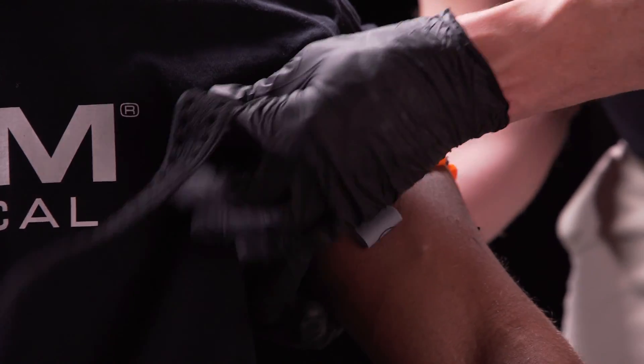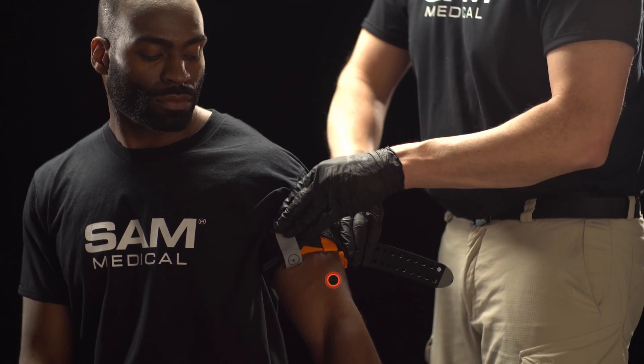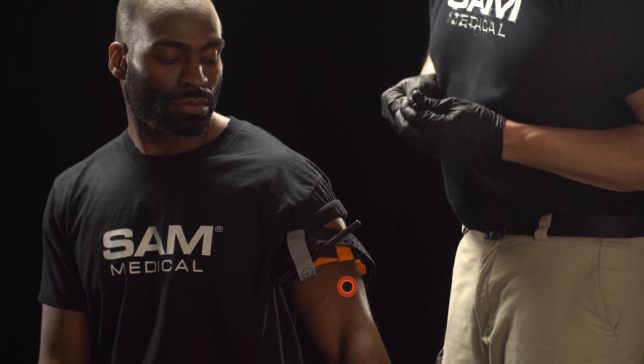Wrap the remaining strap inside the hook, over the windlass and around the limb. Secure the time band over the hook and record the time of application.